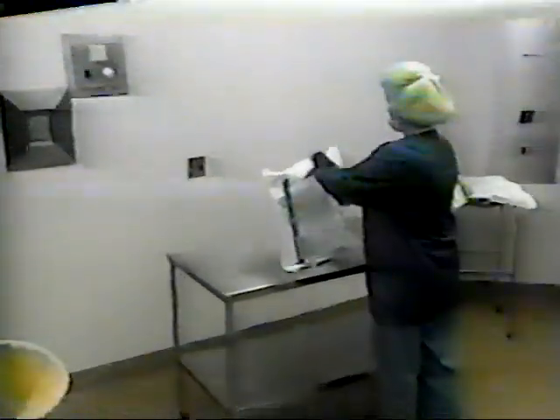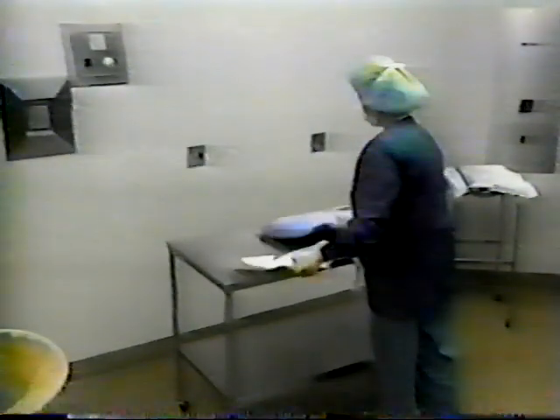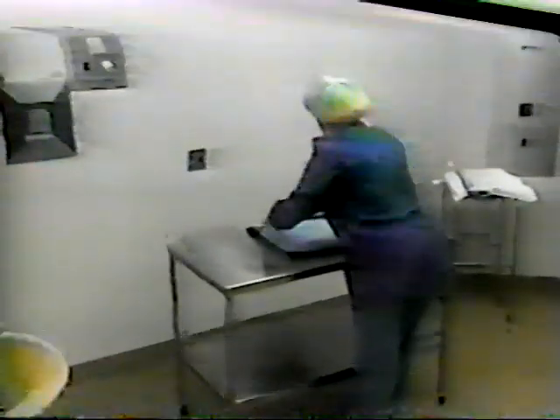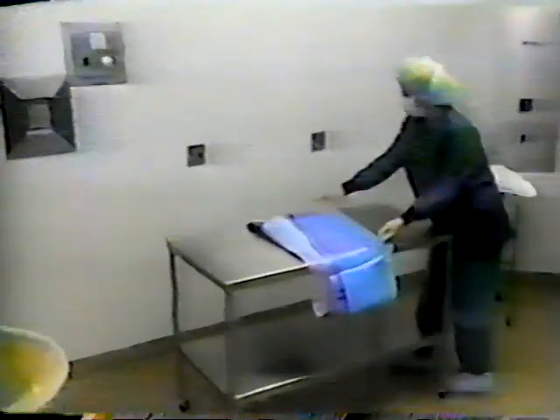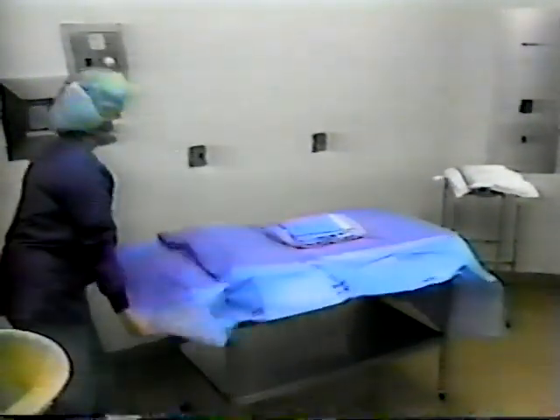In opening large packs, the cover becomes the barrier to create the sterile field. With some commercial packs, place your hand under the fold of the material. Open the back and then the front flap. Each side flap should then be opened. Care should be taken to walk around the pack and not reach over the sterile field.